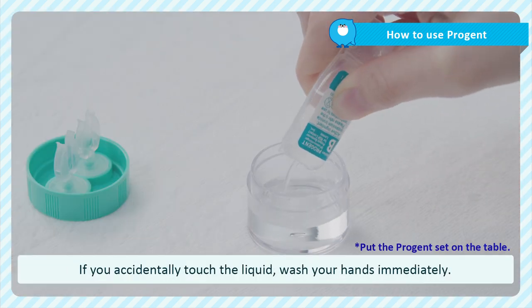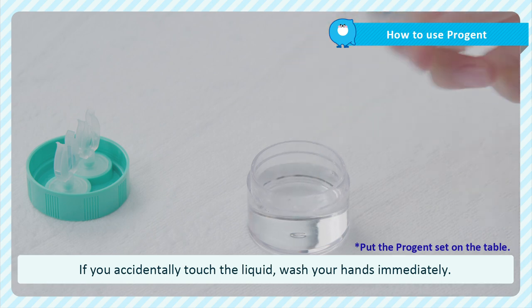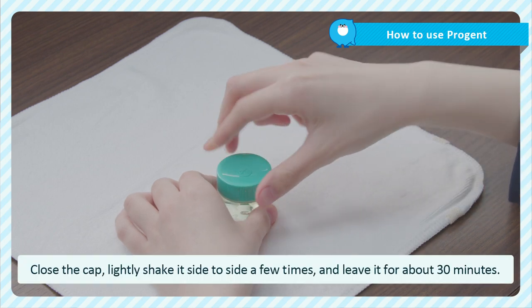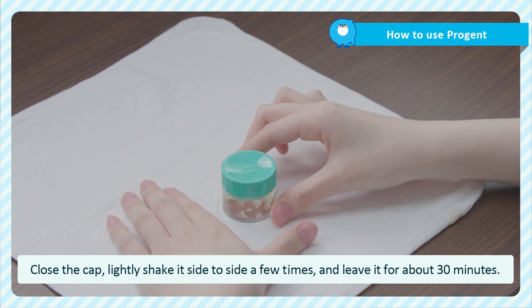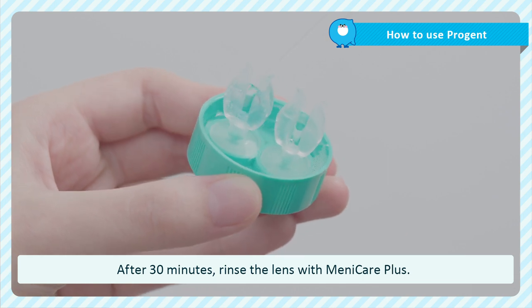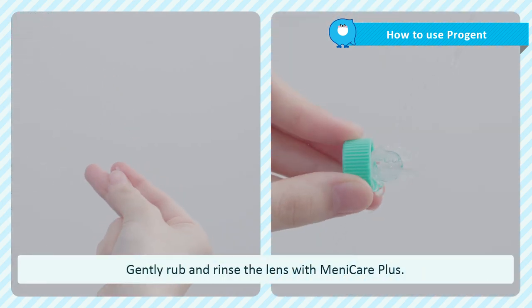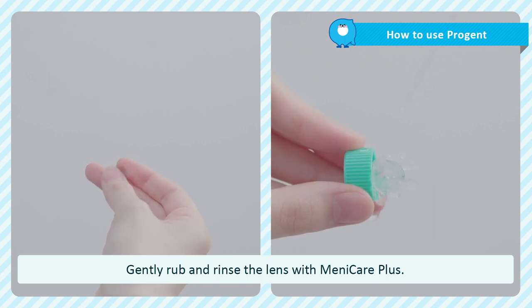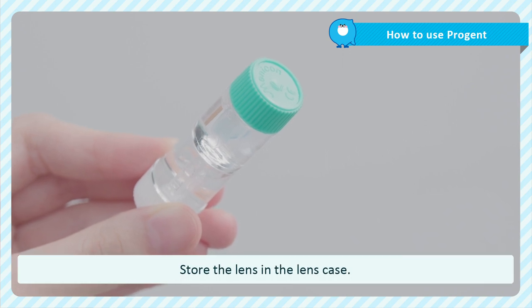If you accidentally touch the liquid, wash your hands immediately as it may injure your hands or eye. Close the cap and lightly shake it side to side a few times. Then leave it for about 30 minutes. After 30 minutes, rinse and rub the lens with ManyCare Plus. Put the lens back in the lens holder and rinse with ManyCare Plus again. Store the lens in the lens case.